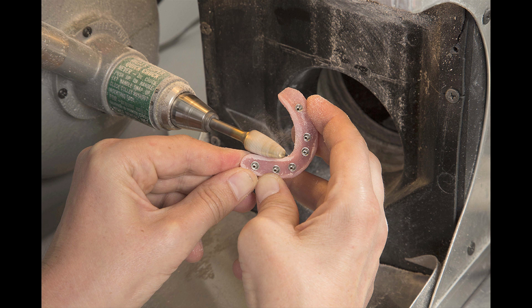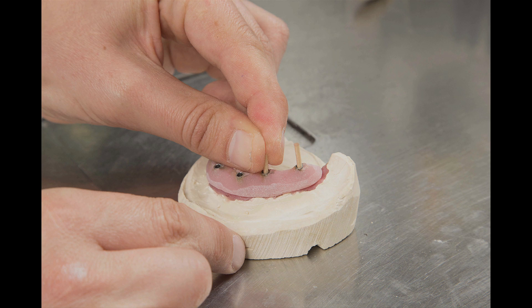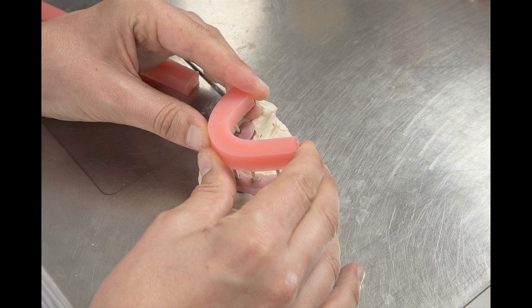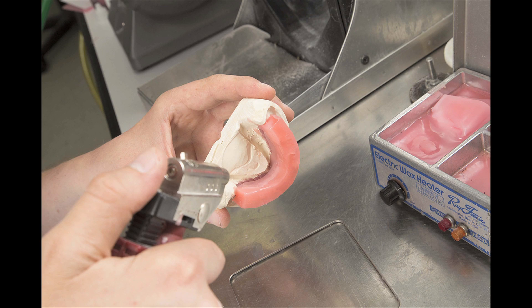The now hardened facial and lingual flanges are reduced so that they are scalloped and short, and do not extend over the ridge. The titanium cylinders, which remain attached to the trimmed base plate, are screwed back into the working model and cut down to within a few millimeters of the base plate. Pins are placed inside the shortened cylinders to prevent wax from flowing into the holes, allowing continued access through the cylinders to the underlying screws. Wax bite rims are curved to align with the alveolar ridge, placed over the pins, pressed down, and formed over the base plate. With a hot wax iron, the wax rim is attached to the base plate and shaped, and is then smoothed with a butane torch to form a solid, uniform bite block.